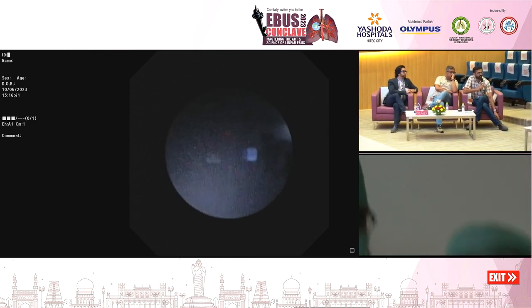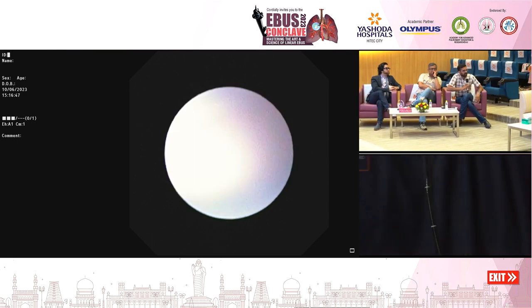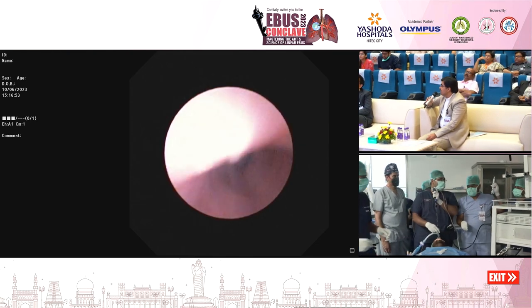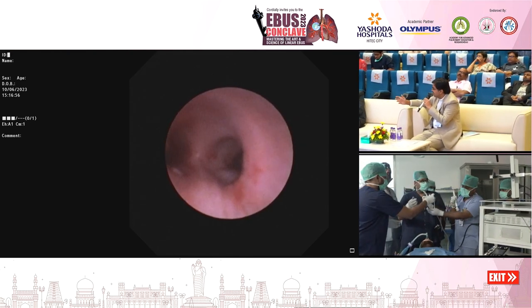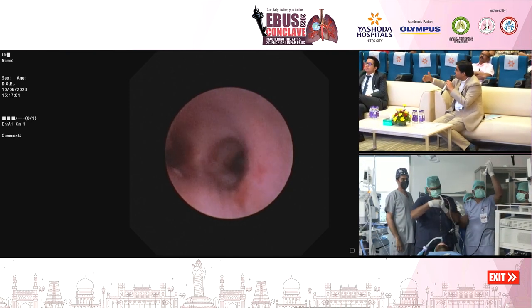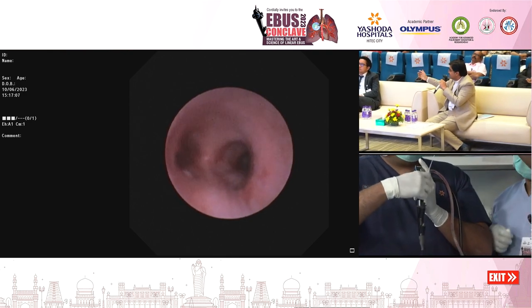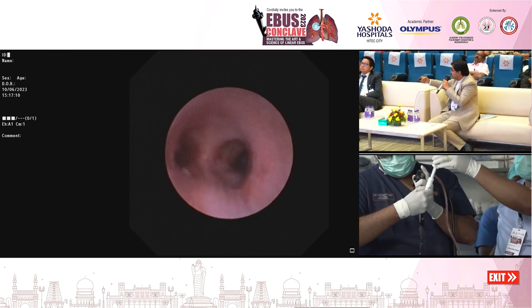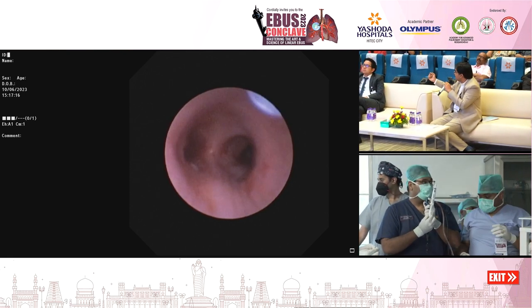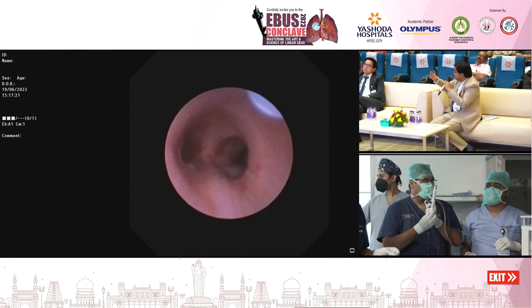How many cores do you target? I don't think there is any answer for that question. The ideal number of cores, I think, is three or four, which is what we normally tend to get. And the core needle is one where, as I have said, the majority of times you get a core. When we look at our data, of all the cores we get, not every core is a true core. True core means that it has cells and not blood. A false core means it either has cartilage in it or it has only blood. Sometimes what looks like a core macroscopically can just be a piece of cartilage or a blood clot. So only around 80-90% of the cores are actually true cores.